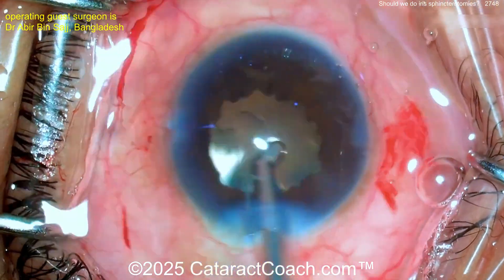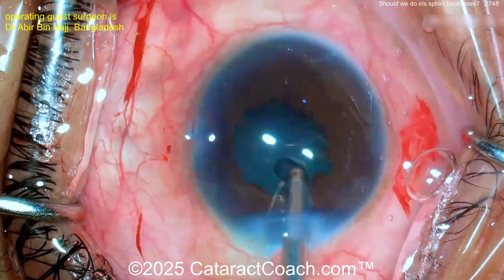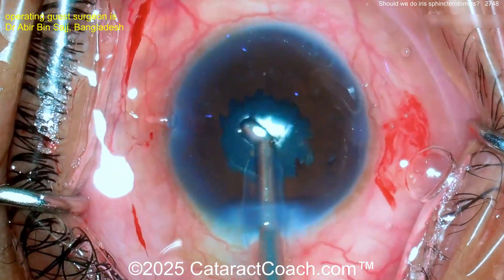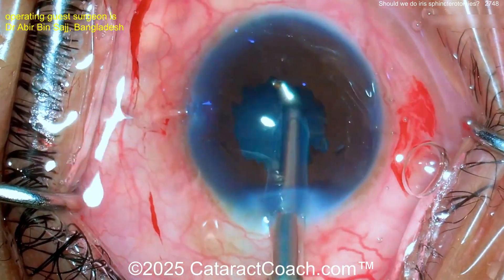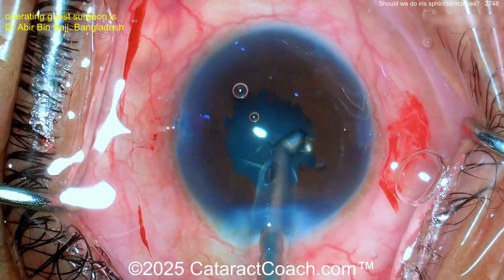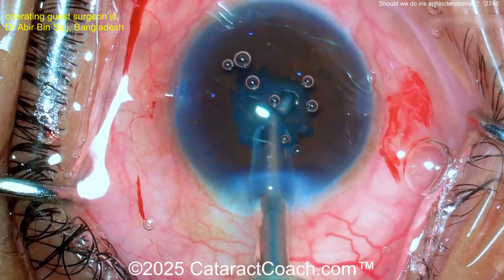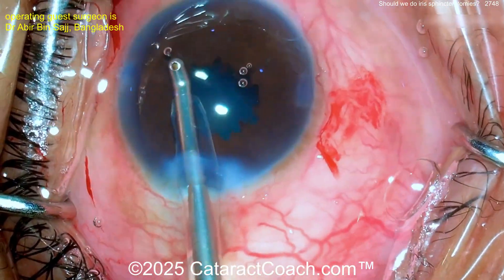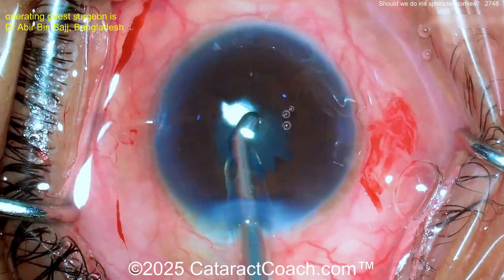Now let's lift up the iris and check — that's what I'd want to do here. This looks pretty good; it looks like the lens is in the bag. The only way to know for sure is to lift up that iris, visualize the rhexis, and make sure the IOL is behind it. Great technique from this surgeon — obviously works well in their hands.